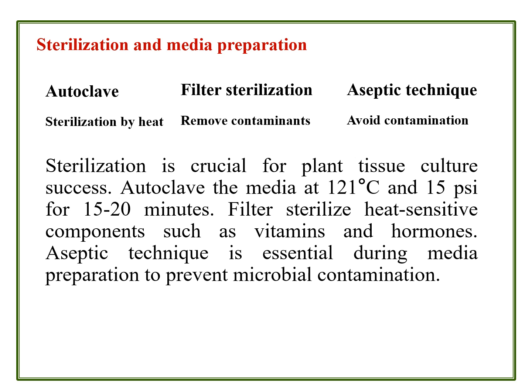The other method is filter sterilization, for heat labile molecules which cannot be sterilized in an autoclave, that is moist heat, or by chemical sterilization.